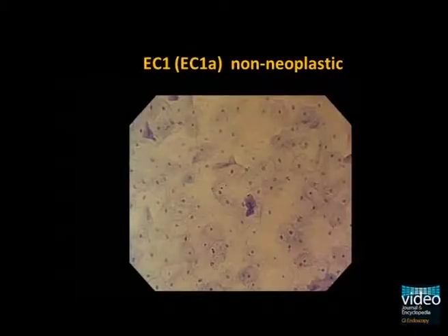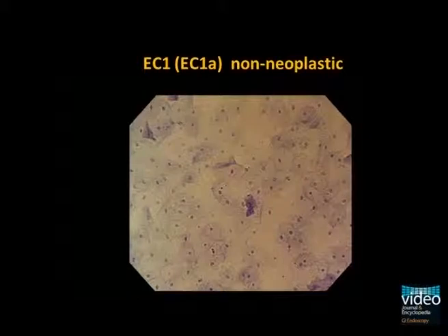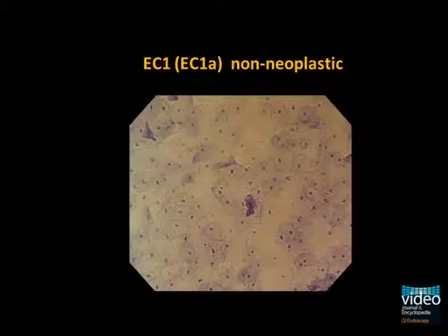In the typical image of EC1, rhomboidal-shape squamous cells with compact nuclei are observed. This is a characteristic image for the non-neoplastic region.